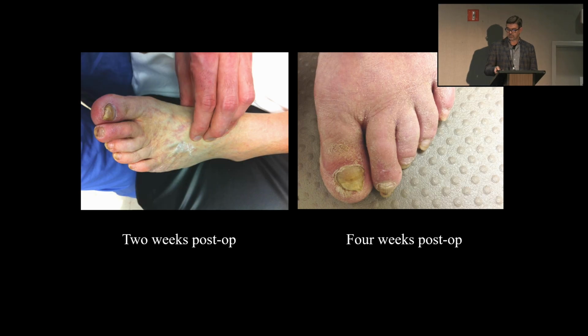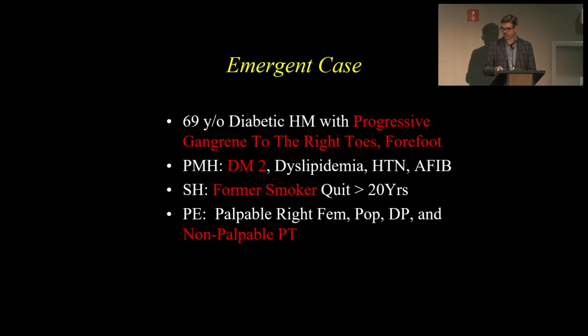And post-procedure, 2 weeks later, I could feel a good pulse. She has desquamation of the skin. That means she's making more skin. Things are healing. So it's important to look at your acceleration times, but it's also important to look at the patient. Look at this too and say, yep, this is evidence. There's evidence that this is working and things are going properly.